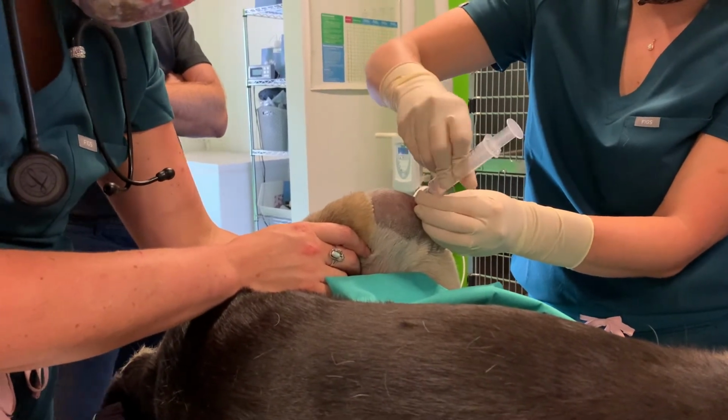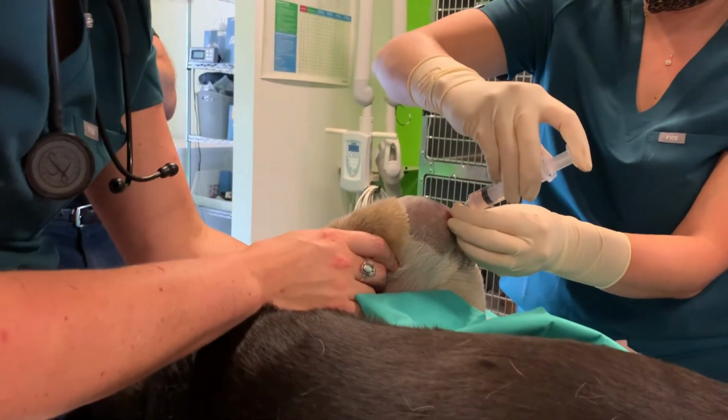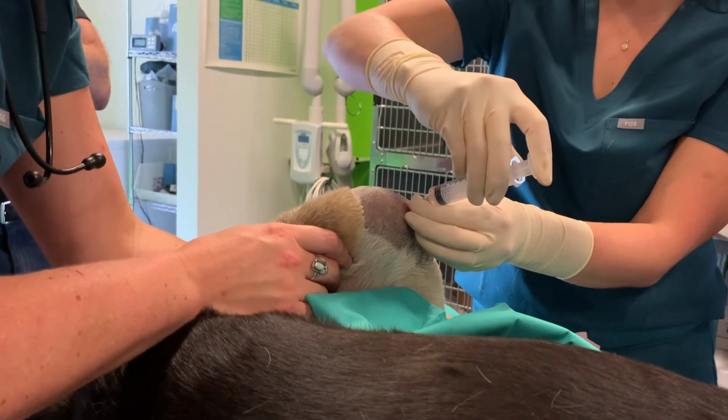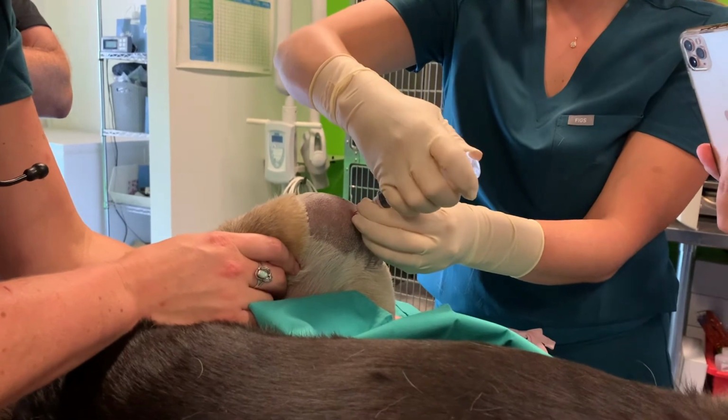There you go. And we've got no resistance. It's an empty joint. No pressure.